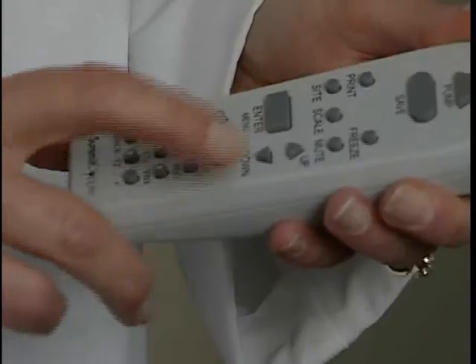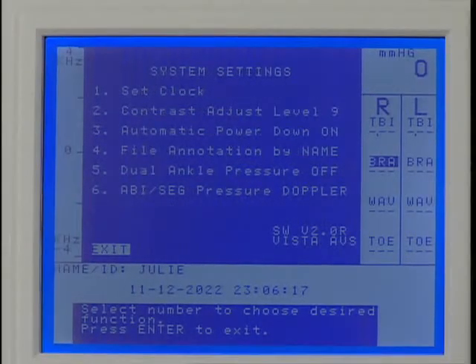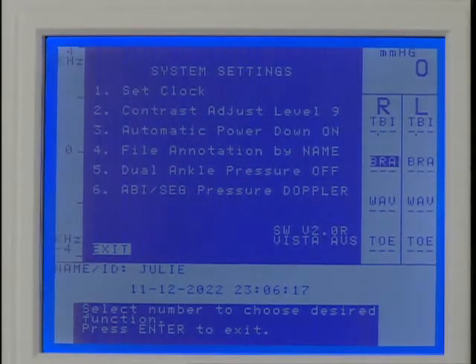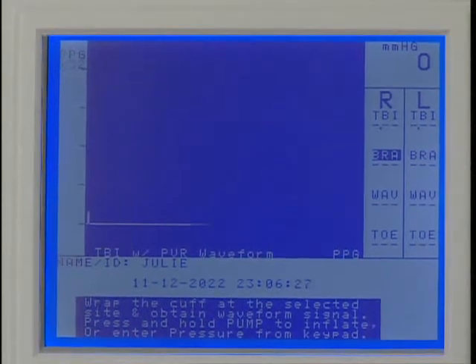To begin, press ENTER MENU to open the options menu and press 2 for system settings. Press 6 to select PPG for obtaining pressures, then press ENTER MENU to exit.